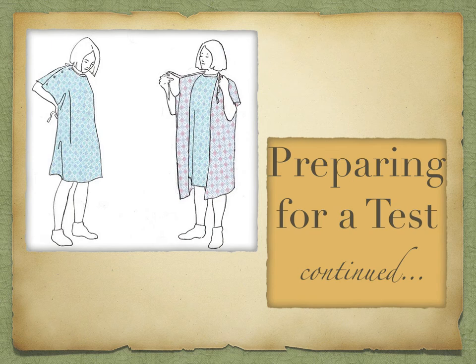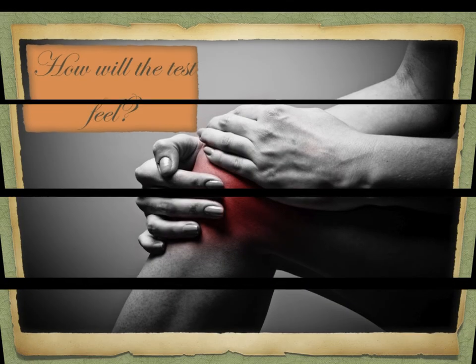The patient is also encouraged to drink a lot of water, as the radiation should not collect within the bladder, and they will be asked to go to the bathroom before the test. If the bladder is full, it can block the camera's view to the pelvis and cause for wrongful interpretation. Also, doctors may ask the patient to sign a consent form.